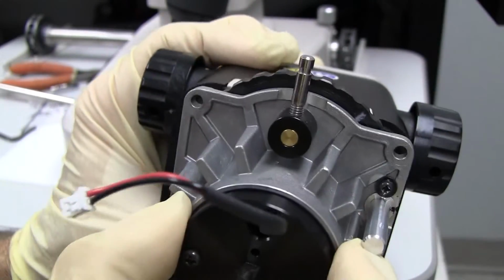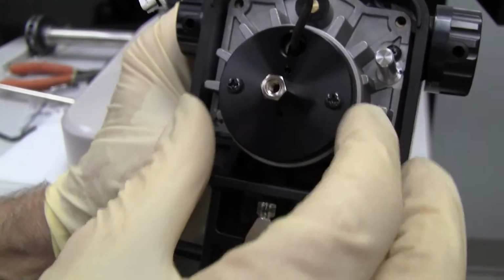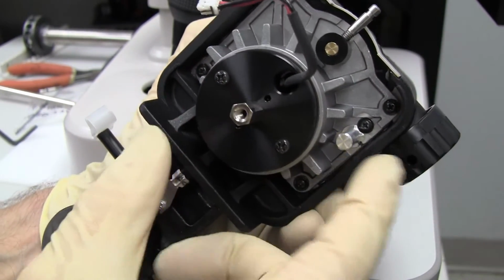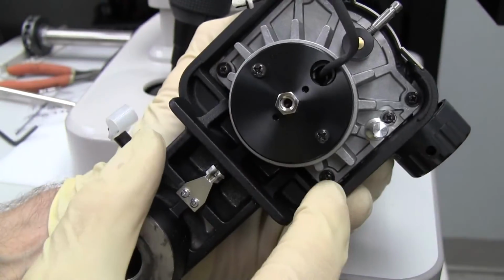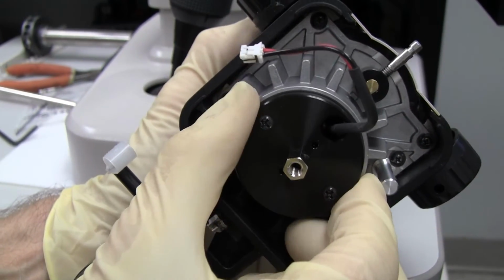Back in. Four screws. Even though you have your 4 screws in, the reason why you have this cam adjustment is because there's space that this whole assembly can move around.